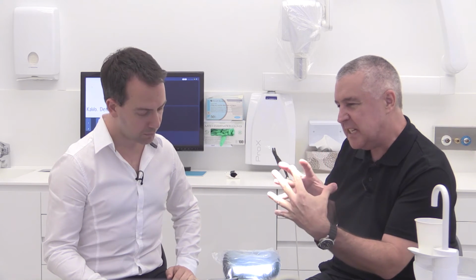Yeah, because what we often forget is when a tooth is pushed either lingually or buccally in that situation, the carious lesion is going to occur in a different place. It's never going to be where it was originally going to be, sitting under what was the original contact points. It's going to be tucked in where those contact zones are, where you've got that really dense, mature plaque. So we still have to recalibrate where we're going to look anyway.